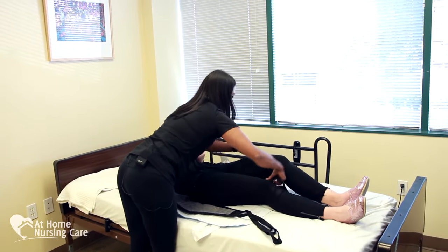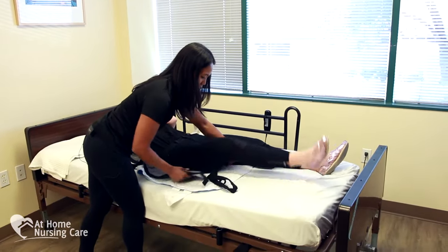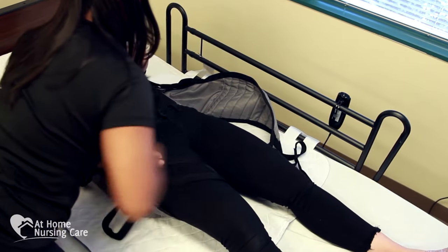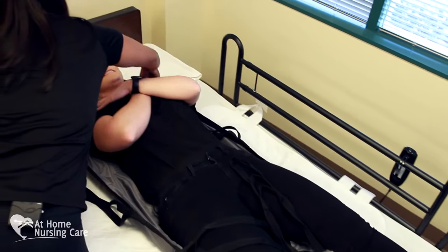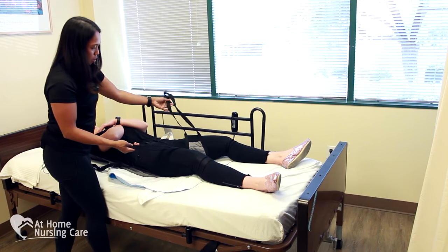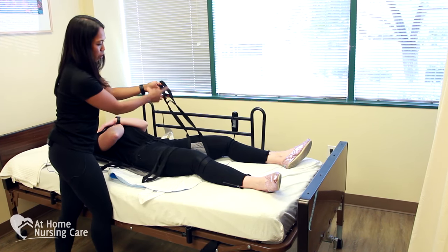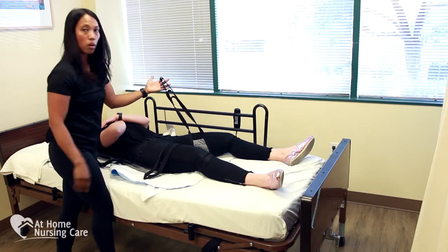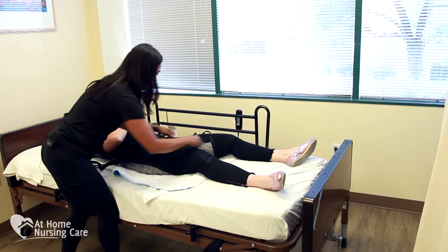The lower part of the sling has two leg pieces. You want to tuck them underneath her leg, approximately three to four inches above the knee, and they cross underneath. You don't want any bunching of the sling, as it's going to be an irritation to the client, especially if she has sensitive skin. With the sling, there are adjustable hooks — if your client is tall or short, we can use different hooks. The longer the client's legs, the longer the piece you would use, but it's all based on the comfort level of the client.